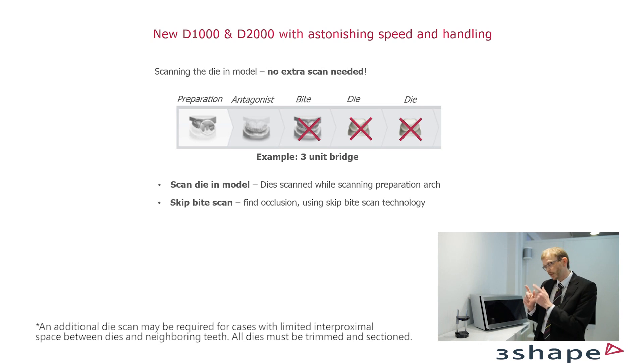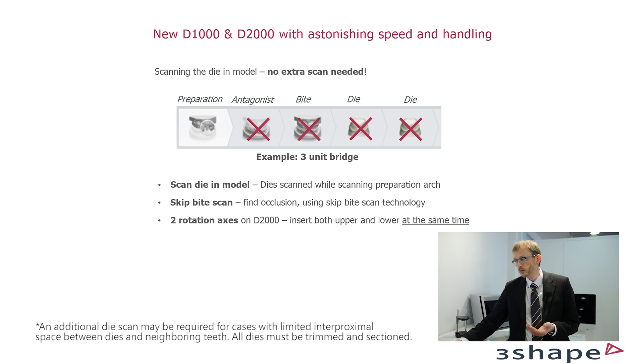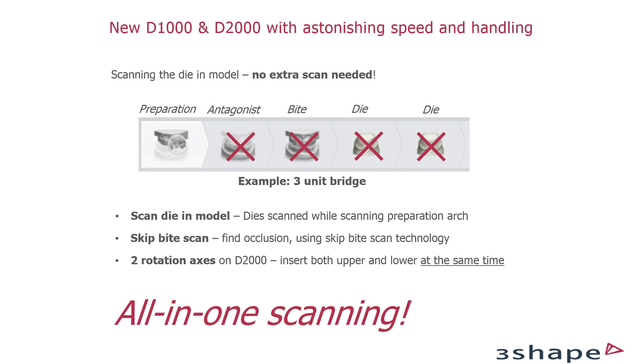There is actually another way of skipping the bite scan — I'll come back to that in just a second. As you saw, I can put in both the preparation side and the antagonist at once, so I don't need an extra operation to scan the antagonist. That leaves one operation — what we call all-in-one scanning. You can do everything in one go. Now you might ask: can I do this on all cases? Well, not all cases, but the majority. There are cases where the neighbor is leaning so much over the preparation side that you really can't see the margin line, but in that case you simply scan the die separately. We made a short video to illustrate the difference between traditional scanning steps and the brand new all-in-one scanning now possible with the D2000.